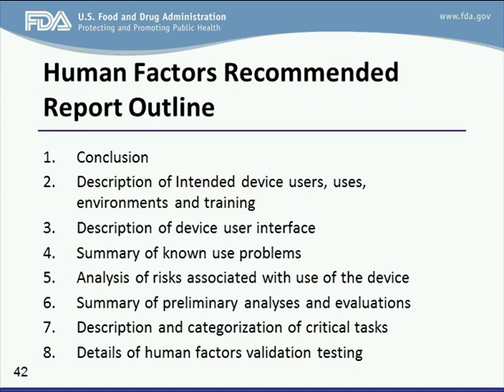It's worth pointing out that it is equally important to discuss the intended use environment, as well as describe your user interface, because that information is necessary for the agency to review your human factors testing data.